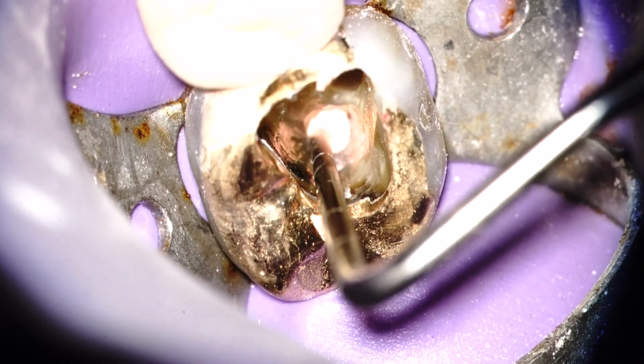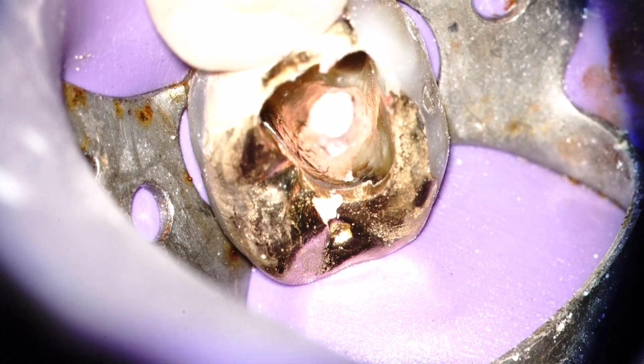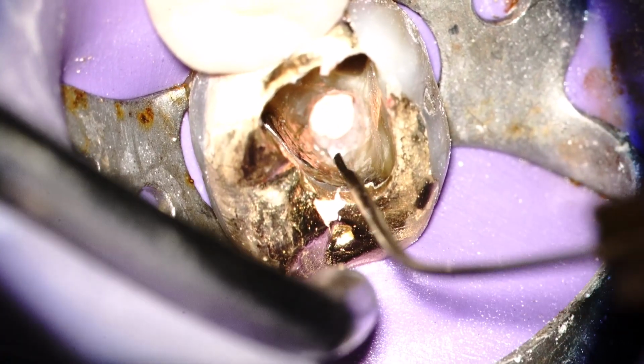So we've filled all the canals, and on the mesial buccal canal, we've filled it just to the level of the base of the resorption defect, which has been prepared, and we have fantastic hemostasis. Now I'm applying chloroform to dissolve and remove all the excess gutta-percha. Use a round micro brush to swipe it away. Then I apply alcohol to stop the reaction, and then clear all the gutta-percha away. This is what it looks like, completely cleared and cleaned after obturating.